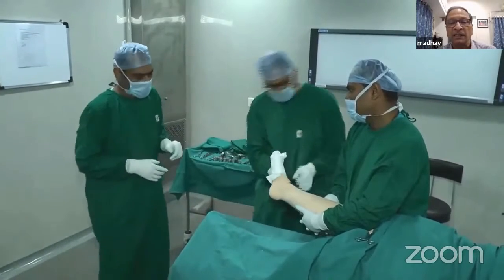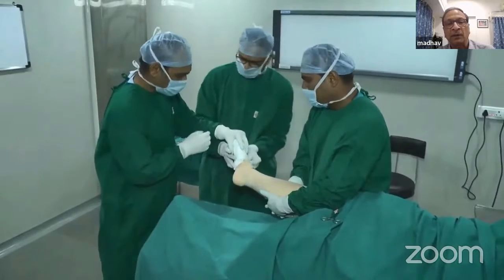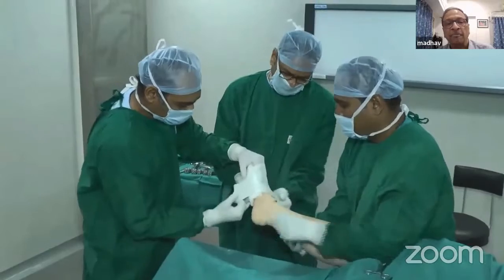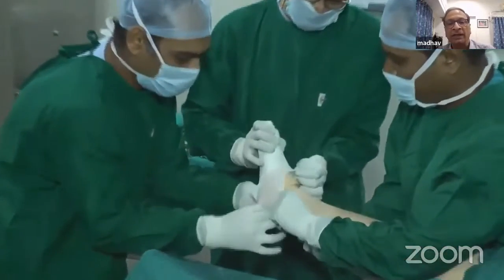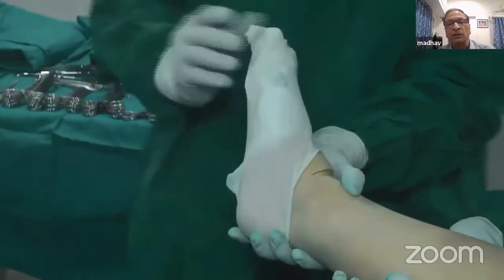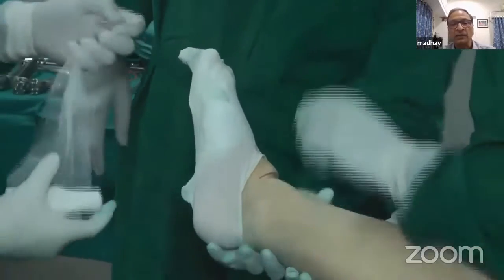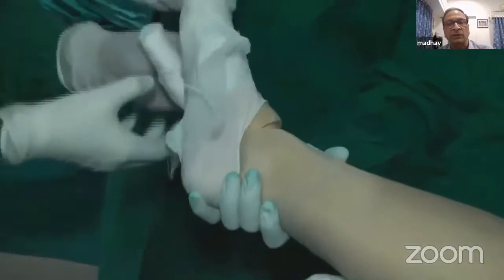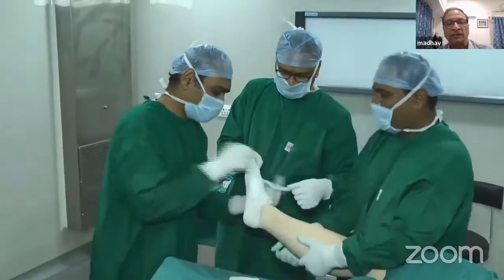Depending on the surgical area you are operating on, you need to cover the part of the foot you are not going to operate on with a mop, which you tie a knot around. To keep the mop in place, you turn a glove over it so that it remains in place. You can also put an extra bandage to secure the glove so that it doesn't slip off.